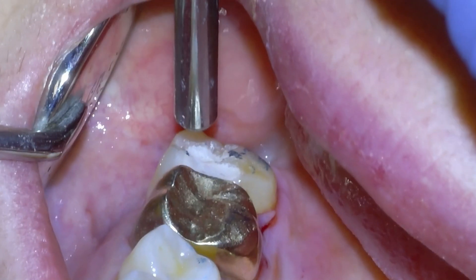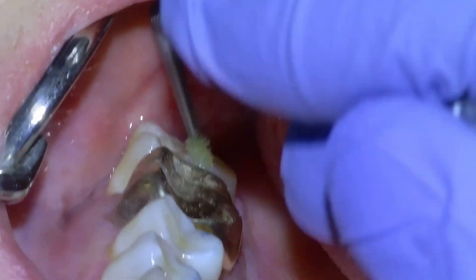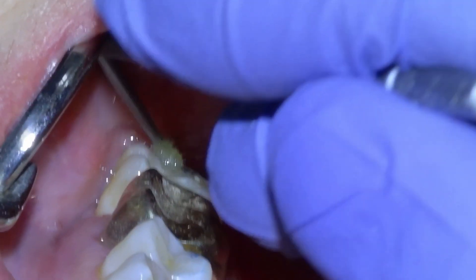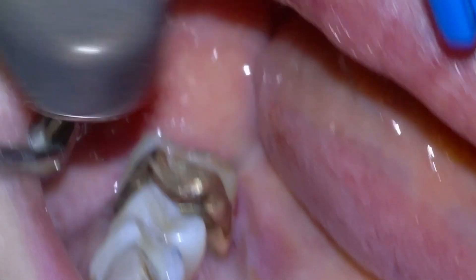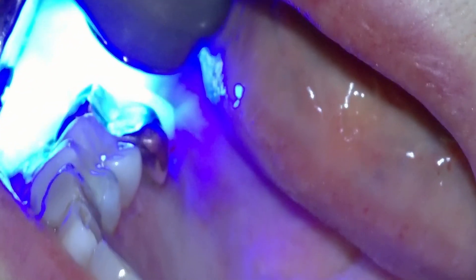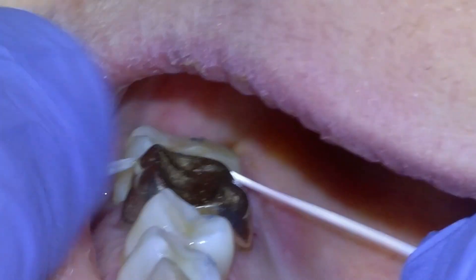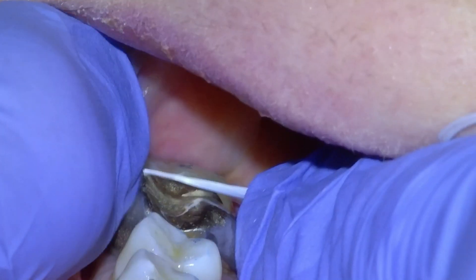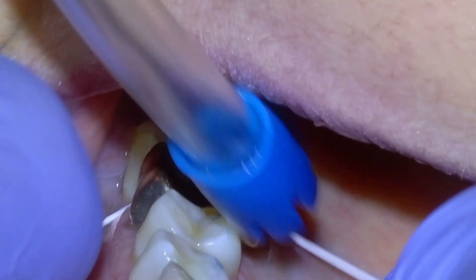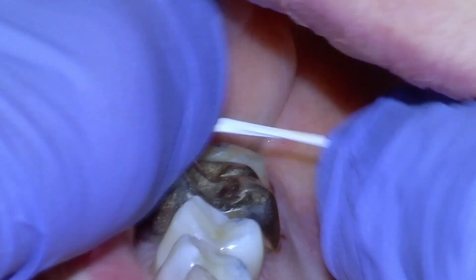And then we'll put on our Acquia coat varnish, light cure it, and that's all done. Video credit for this one goes to Dr. Francisco in Argentina — thank you, Francisco. Hopefully going to be putting out a couple more videos this week. Check the contact with floss and we're happy. Send the patient home and make a plan to endo the 2.6.